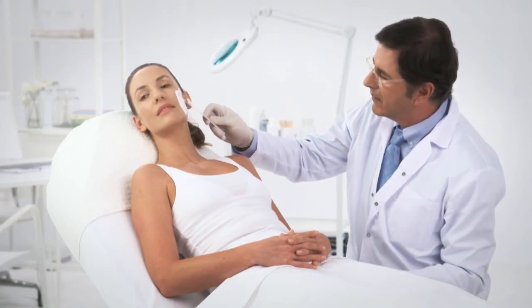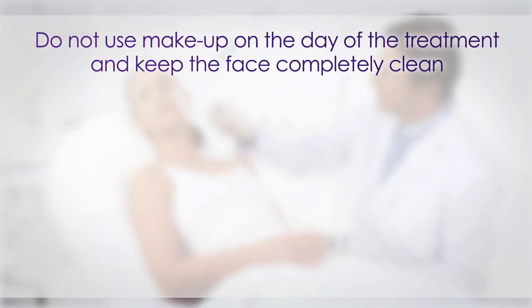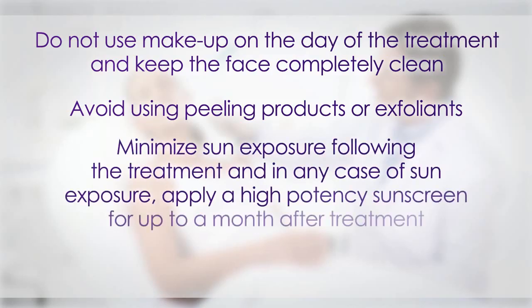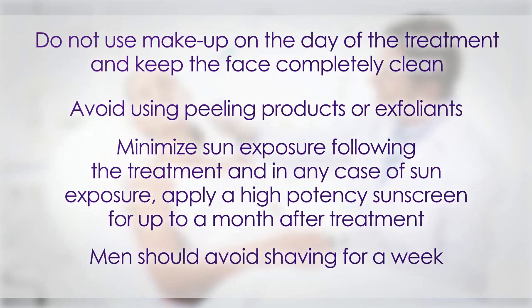After the treatment, patients should pay attention to the following guidelines. Do not use makeup on the day of the treatment and keep the face completely clean. Avoid using peeling products or exfoliates. Minimize sun exposure following the treatment, and in any case of sun exposure, apply a high-potency sunscreen for up to a month after treatment. Men should avoid shaving for a week. Apart from these guidelines, patients can immediately resume all their normal activities. Following the treatment guidelines in the tutorial will ensure optimal results and customer satisfaction.